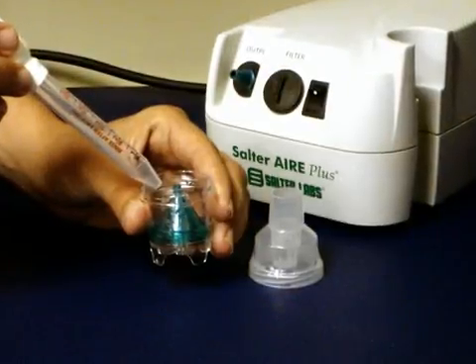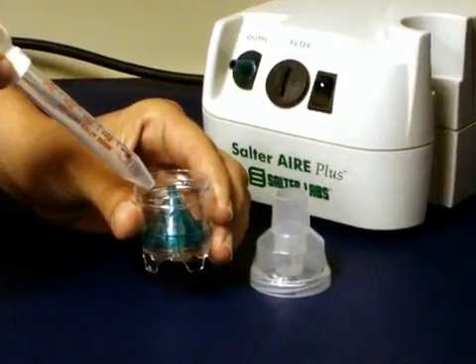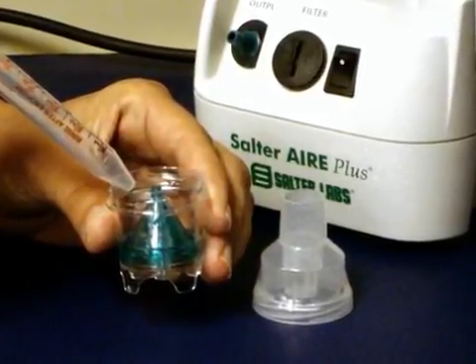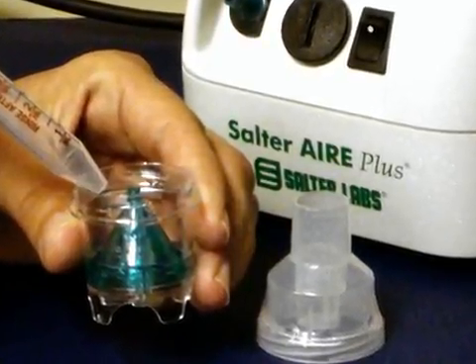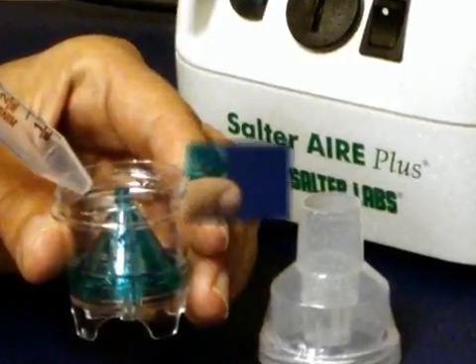Hold the bottom of the nebulizer, or what might be called the medication cup, in one hand. With your other hand, add your medication, as directed by your healthcare provider, into the cup along the side of the green cone. Try to add the medication along the inside of the cup to prevent it from going down the hole in the green cone.